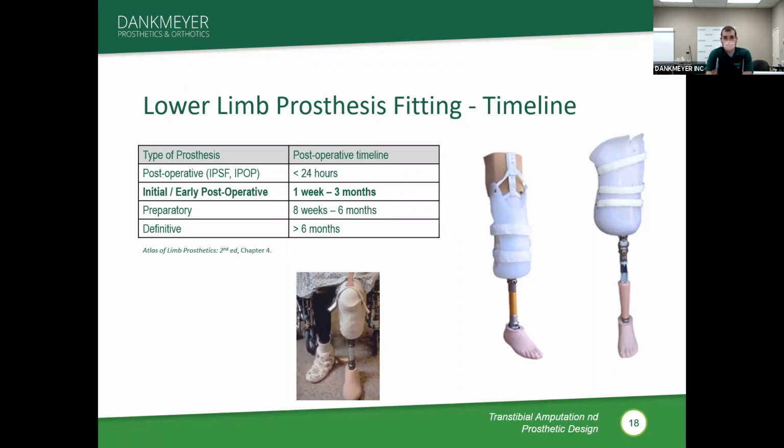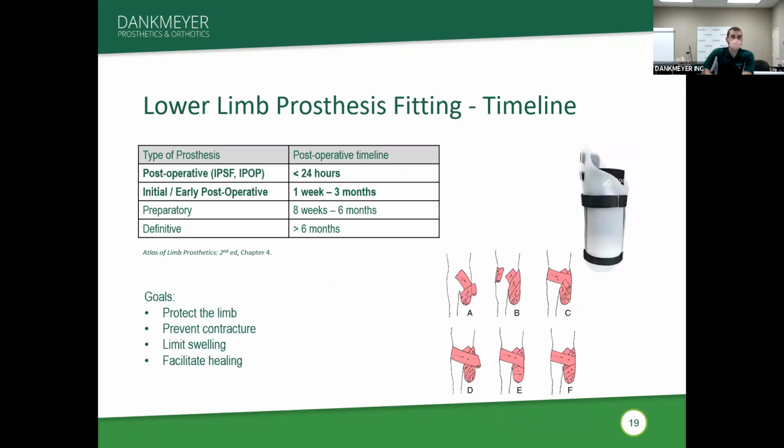Typically with these devices, they're not really meant for walking and even very much weight bearing at all. That's very much regulated. Most of the time it's only toe touch, if any. And a lot of times these are not used, especially in the weight bearing, distal attachment. They're more typically used as residual limb protectors because we want to give that limb time to heal. More common during this early phase, since these two types of devices are not fit very often.